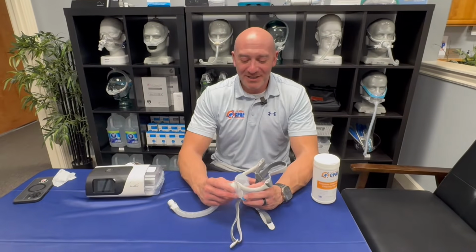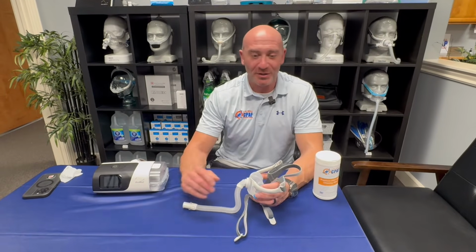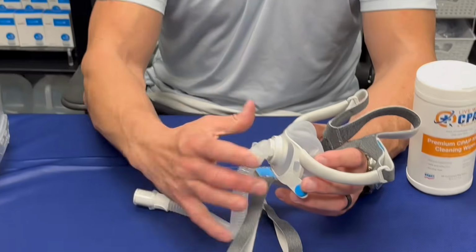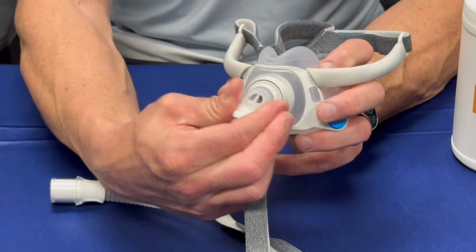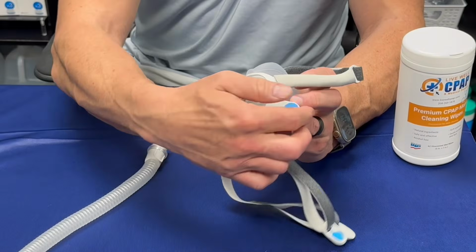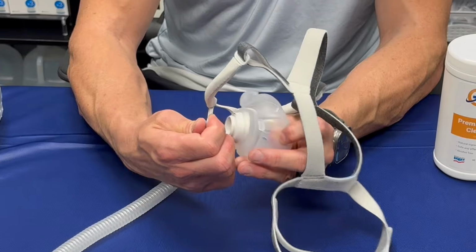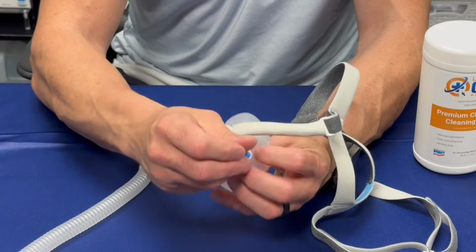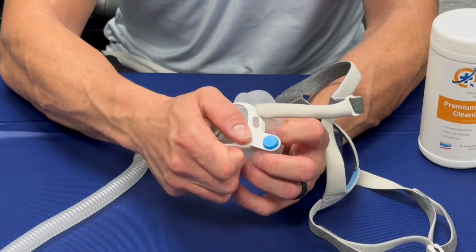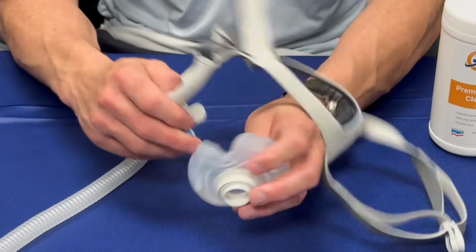Next thing we'll go over is disassembly and reassembly of the F40. It's a very, very simple mask. There's really 4 parts to it. So as far as disassembling, you can squeeze here, as I had kind of alluded to before. And then the cushion comes out of the frame here. This just peels off. You'll notice there's a couple of small tabs here that just kind of go into the frame, and you just pull those out. They're fairly soft and kind of a gummy feel to them.